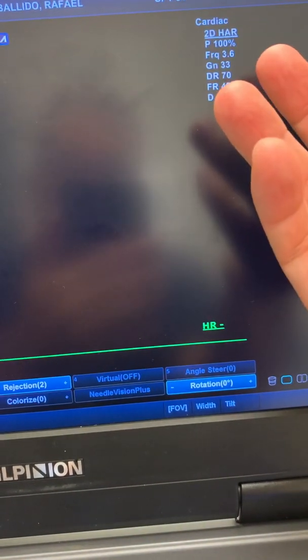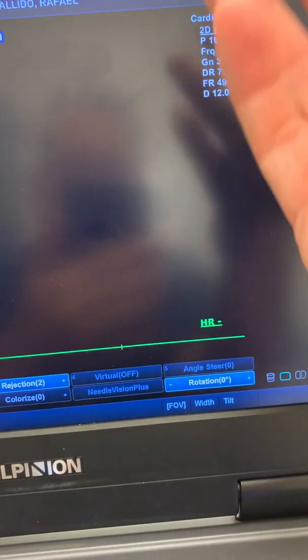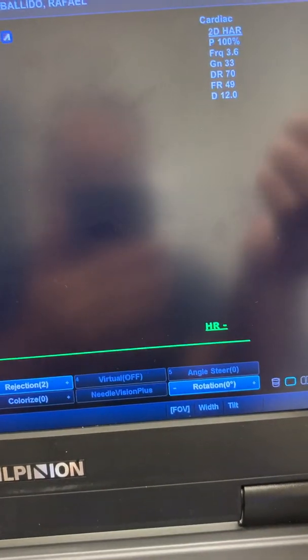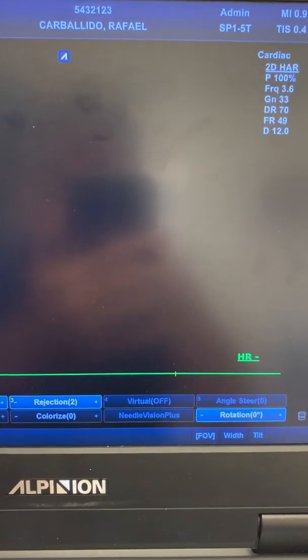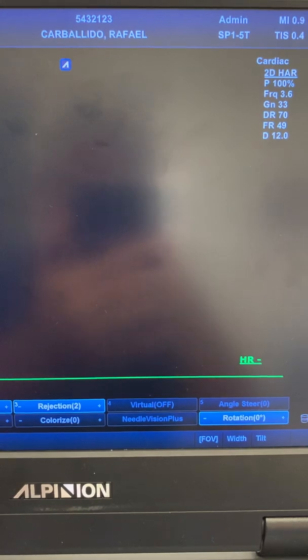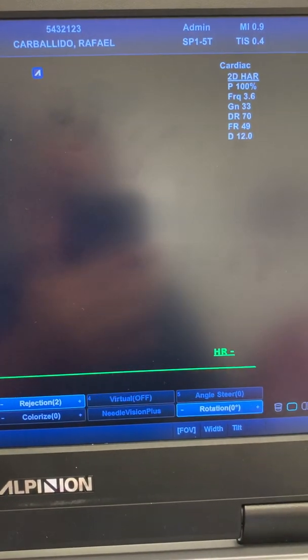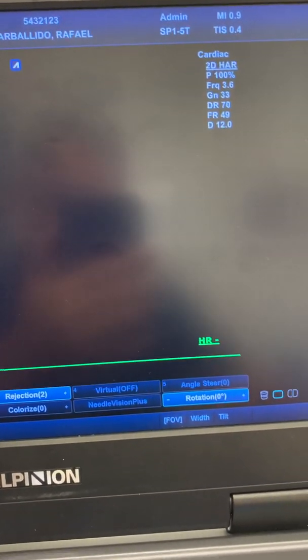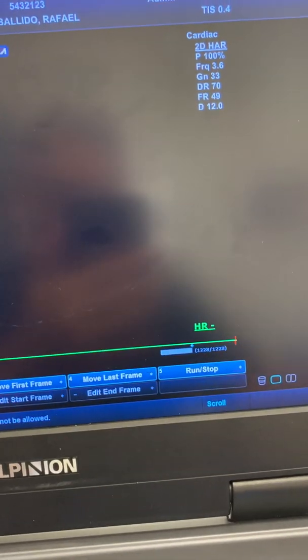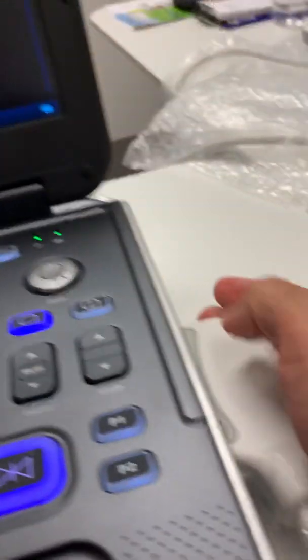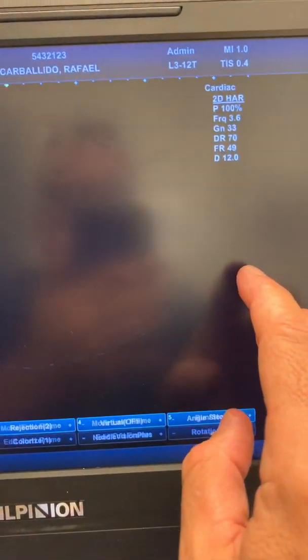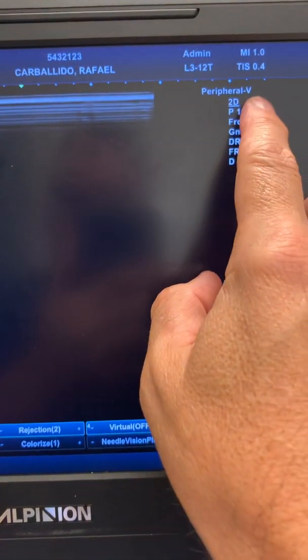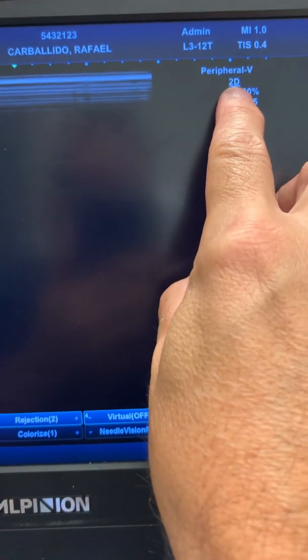We usually use harmonic for echoes, abdomen, renal, pelvic, OB GYN - in all those applications we use harmonic. But let's say we're using the linear transducer and I'm doing peripheral veins.